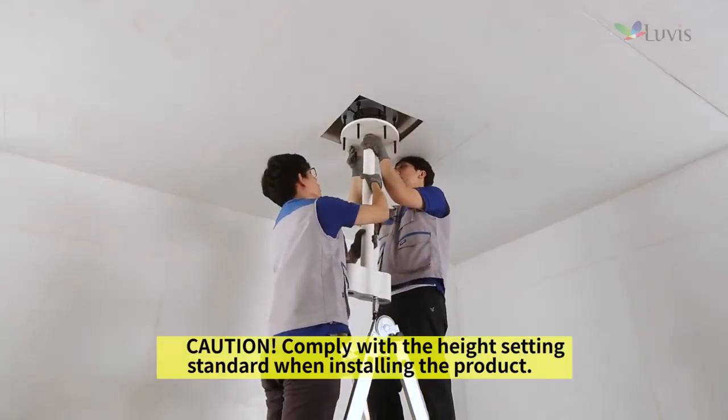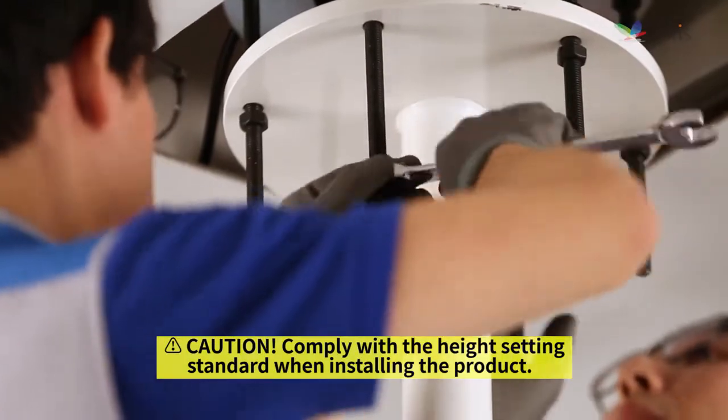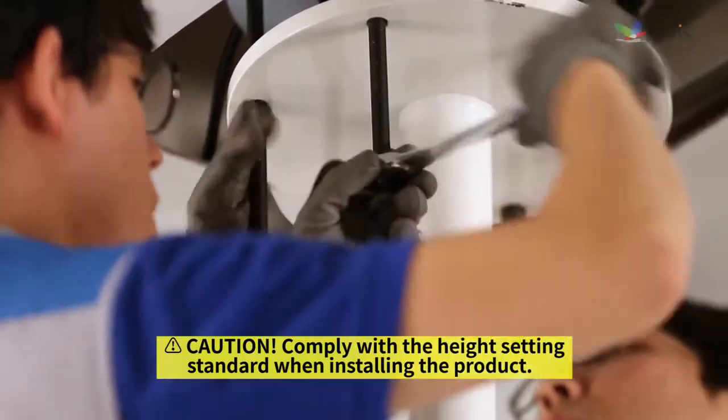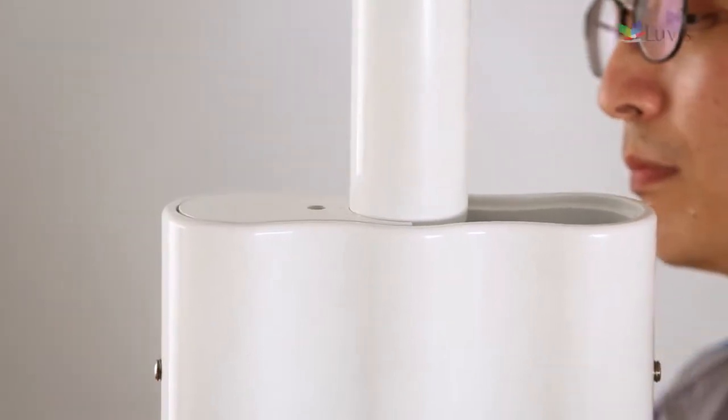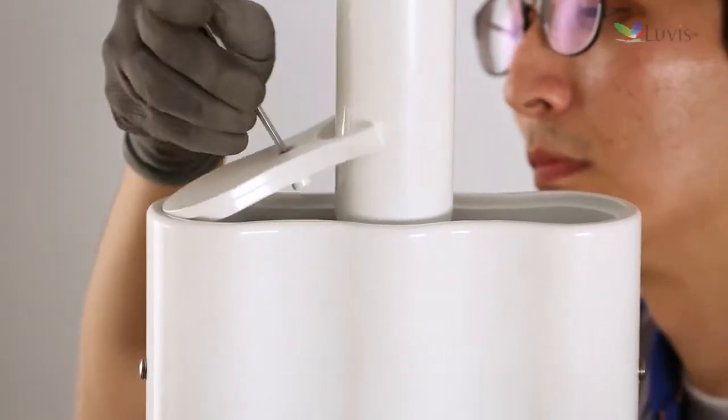Fit the dual ceiling vertical arm installation hole to the bottom of the stud bolt, then fix it with the up-down nut. Open the dual bracket cover by removing the bolt as shown on the screen.